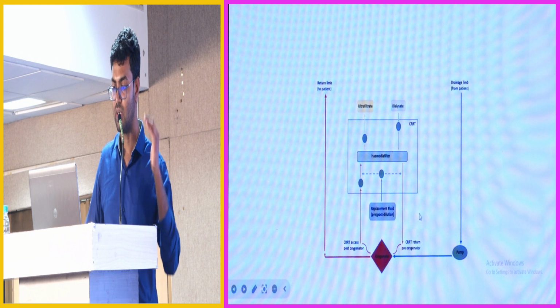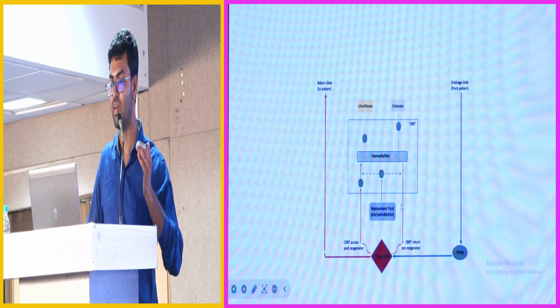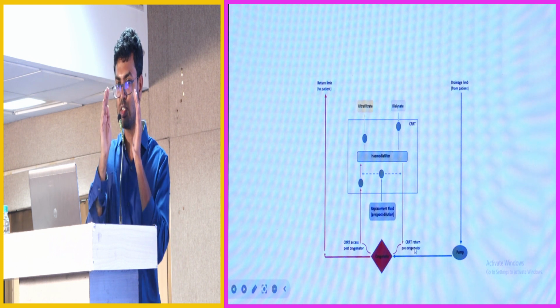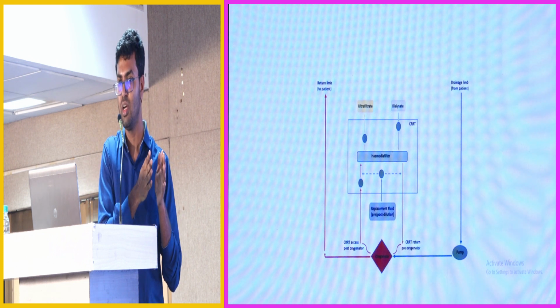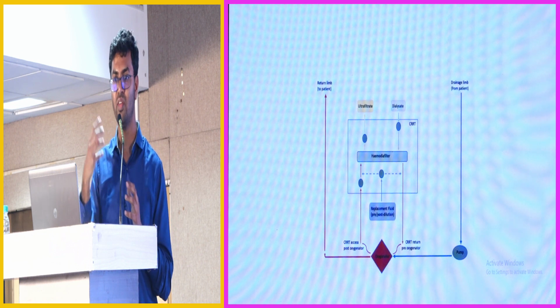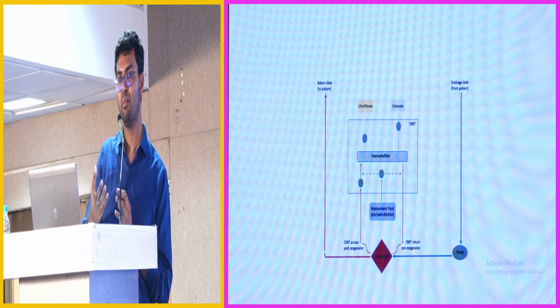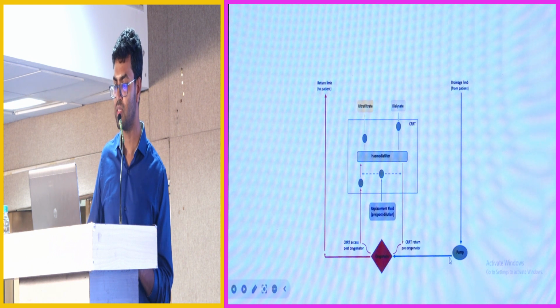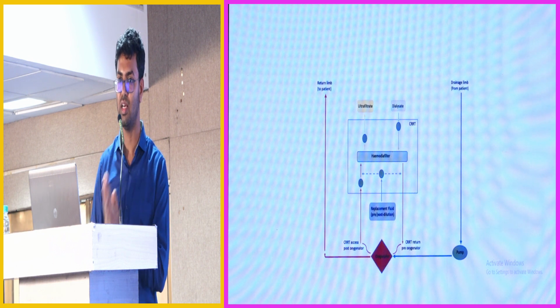So always the renal replacement returning should be pre-oxygenator. That means the blood should return before the oxygenator itself, so that whatever emboli are there will be trapped in your oxygenator. Even though the oxygenator life will decrease, the patient will be saved at the end. So where to take the access port, you can take anywhere. You can take it just after the pump, or just after the oxygenator. So this is the oxygenator. But the most important thing is your alarms.